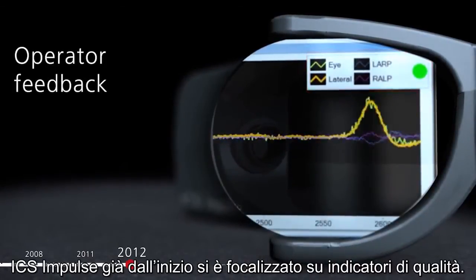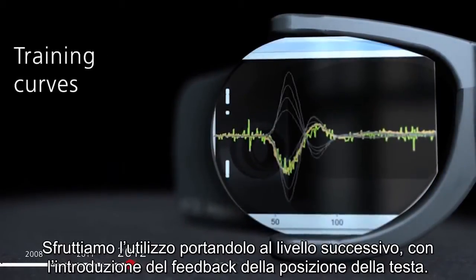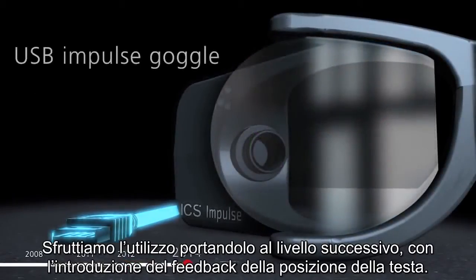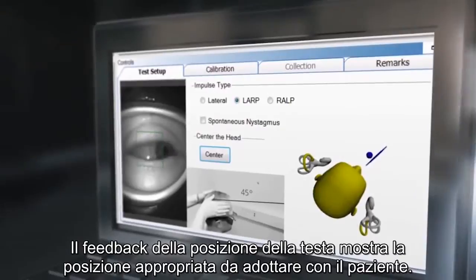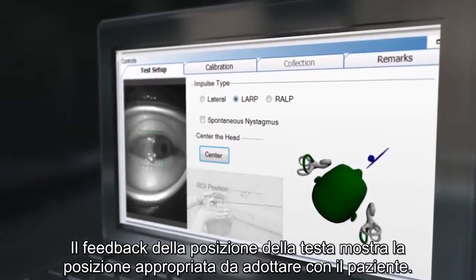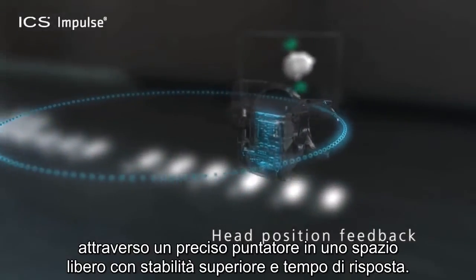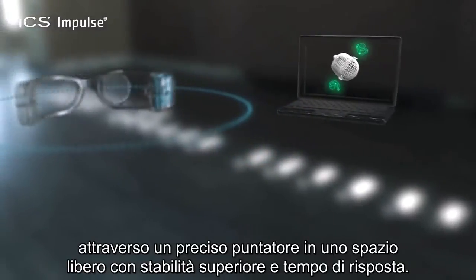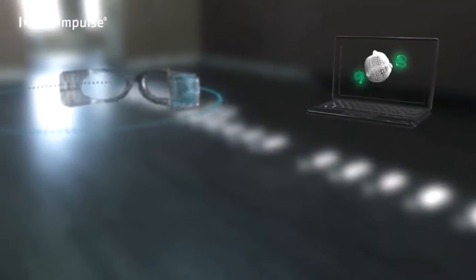ICS Impulse from the beginning focused on quality indicators. We now take usability to the next level with the introduction of head position feedback, which demonstrates the proper positioning of the patient's head by precisely tracking motion in free space with superior stability and response time.